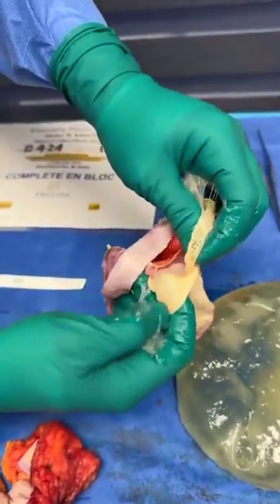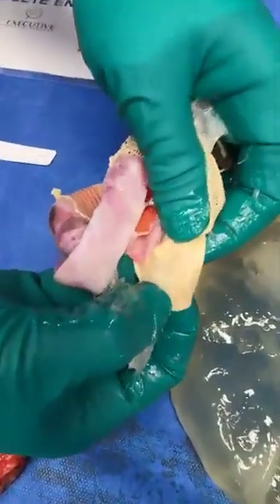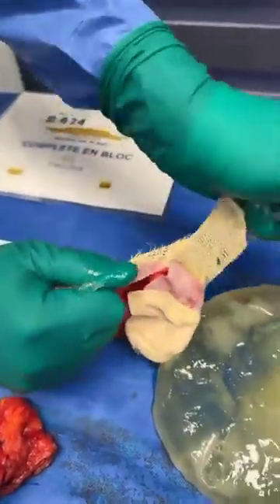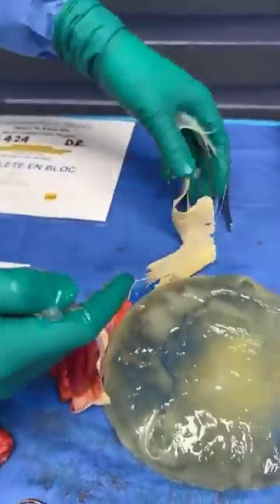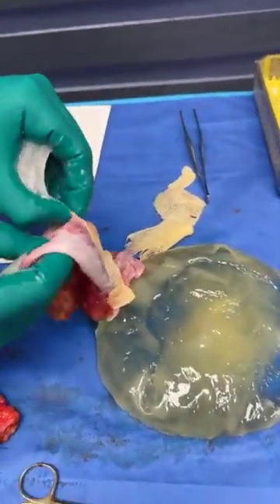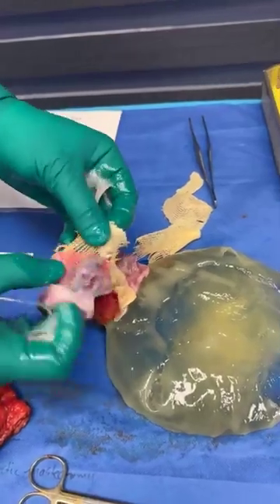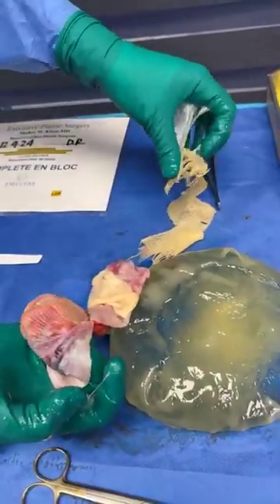Look at the AlloDerm right here. You can actually see the hair follicles from the cadaveric skin. And I'm going to just tear this out. Look at the mesh that was used for reconstruction and reinforcement. And you can see it all over here. Let me go ahead and remove it as well. I'll leave some of it behind.